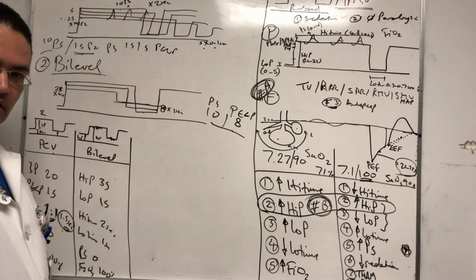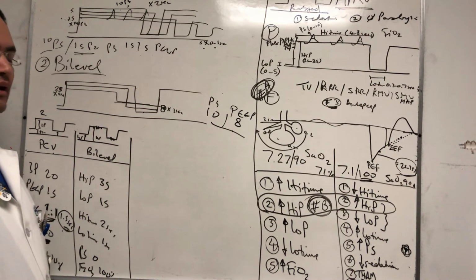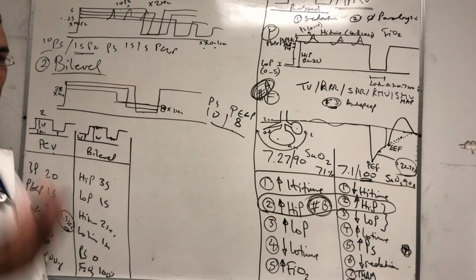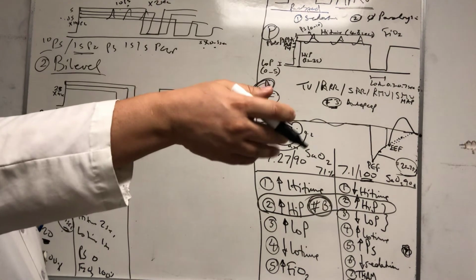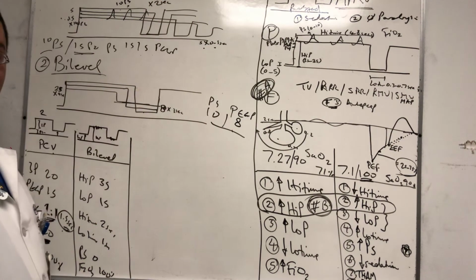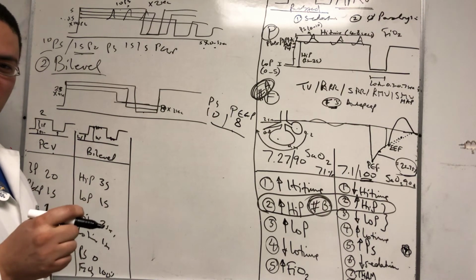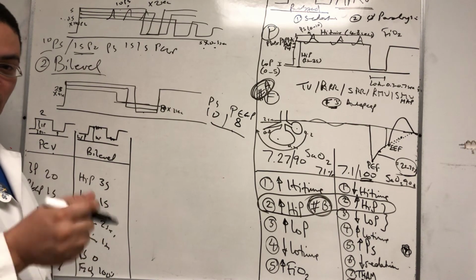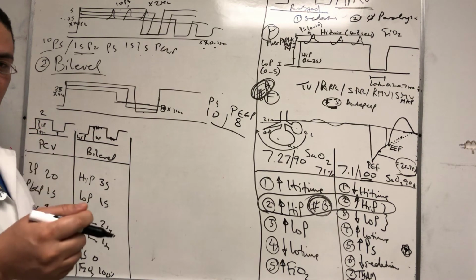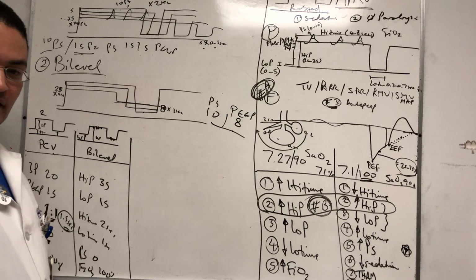So then we're giving her the breath, and Professor Lyon is like, okay, I forgot, you know, the APRV, bi-level, they're all the same. Just go, that mode that Cal likes, what do they call it? The APRV. Put her on APRV, right? So then the respiratory therapist listens to what you're saying and puts her on classic APRV. So imagine Professor Megan with a normal lung. We give her APRV, 6 seconds high time, 35 high pressure, 5 of low pressure, and 0.5 low time.